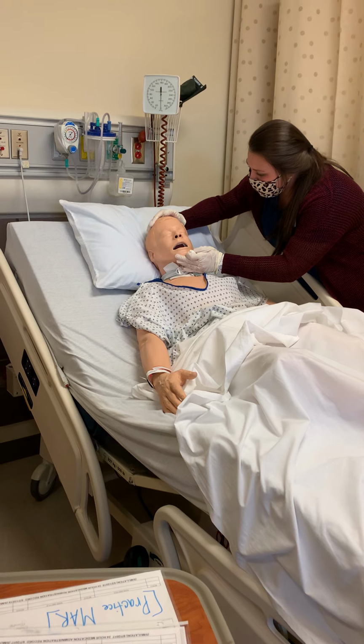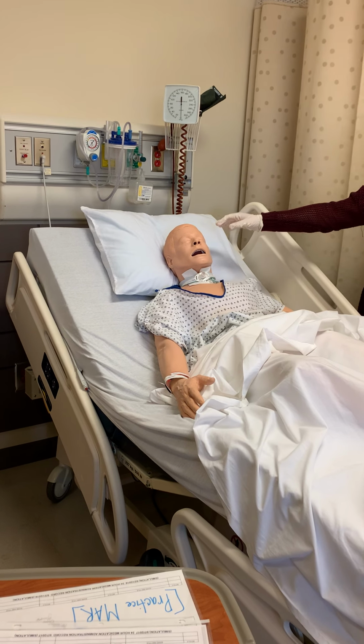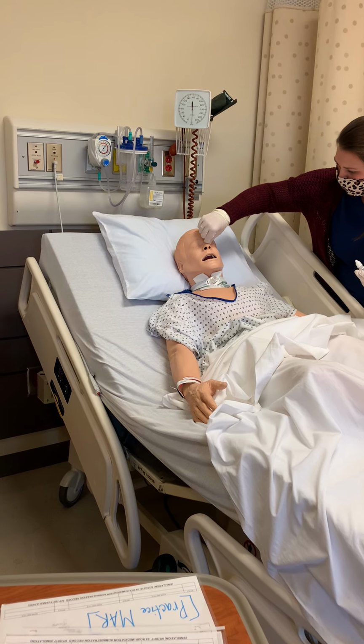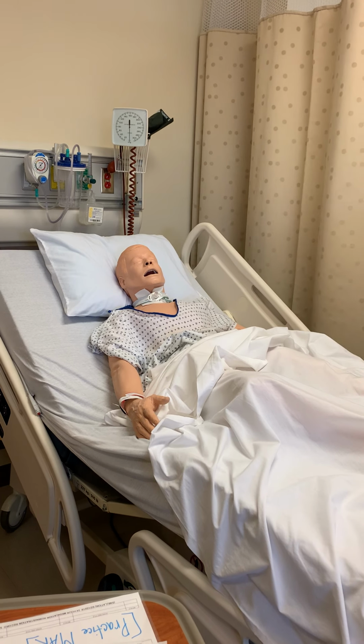I'm gonna put that up and down. 1. With a cotton ball in my hand, we'll press up against it for 2 to 3 seconds. Good job.